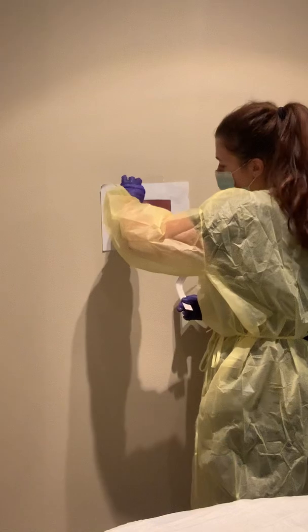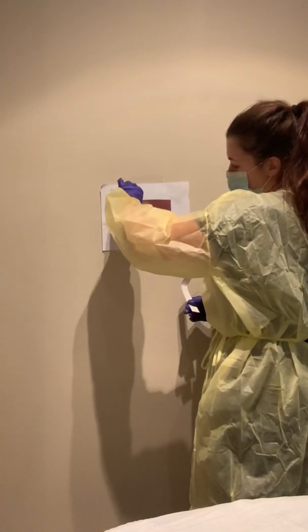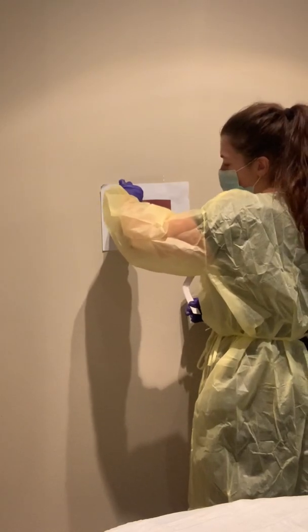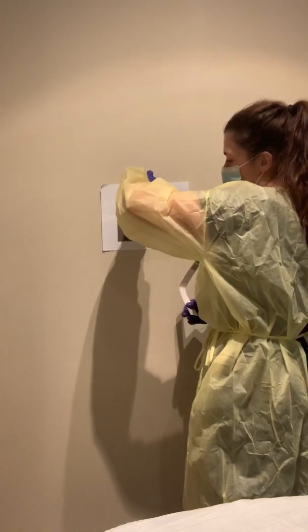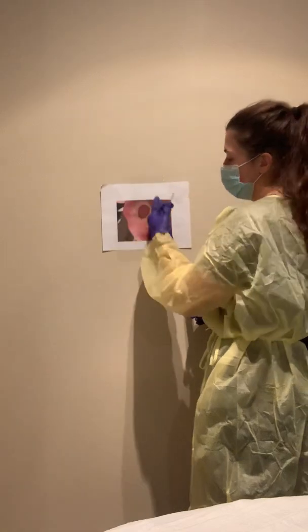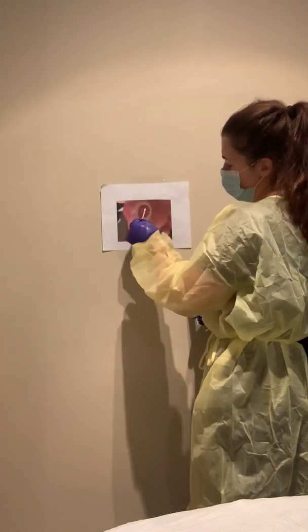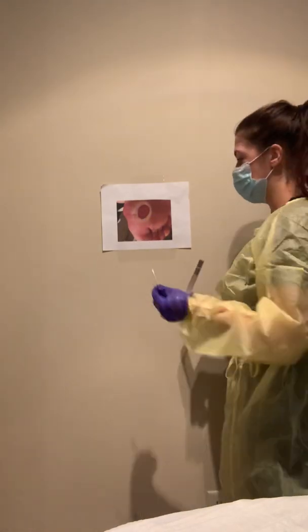So if I were moving this and I started to feel the undermining of the tissue and my cotton tip applicator come underneath that wound edge, I would go ahead and probe all the way along, staying perpendicular until I felt that undermining stop. So if I saw some undermining, I could say if it ended from say 3 to 9, that might be where my undermining may be for this wound.